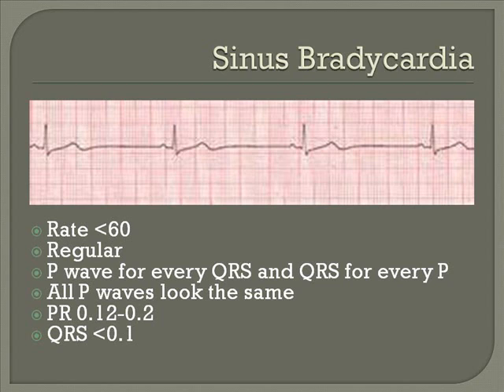If your patient happens to have a very strong heart, such as they are a long-distance runner or ride their bicycle a lot, their heart may be strong and just doesn't need to beat as often as a regular person's heart. Again, go back to the first rule. Look at your patient. If they seem fine with it, then there's no problem.